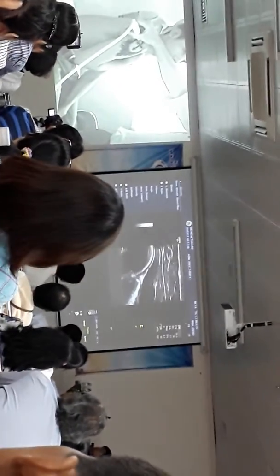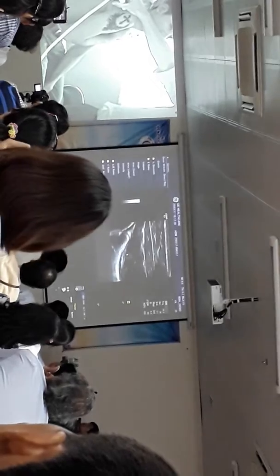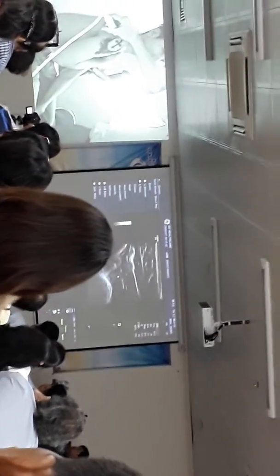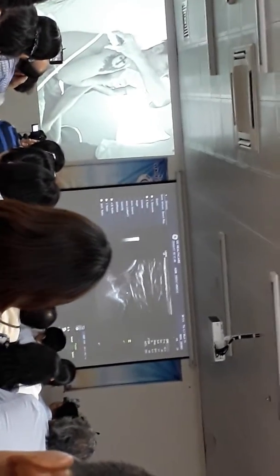So to get to that plane, from the posterior joint, we just slide a little bit more posteriorly and angle up towards the patient's head.